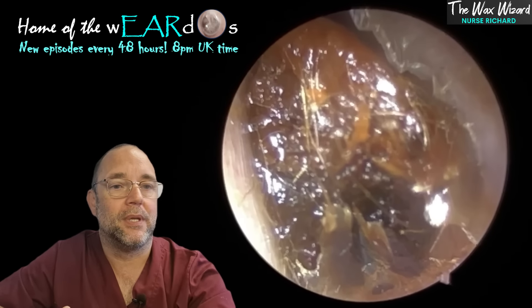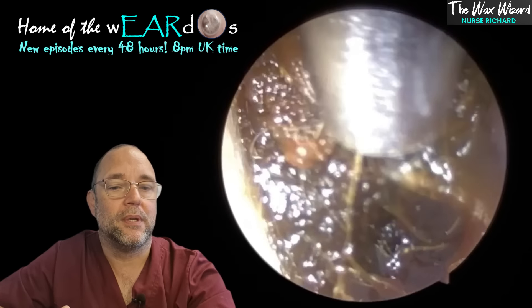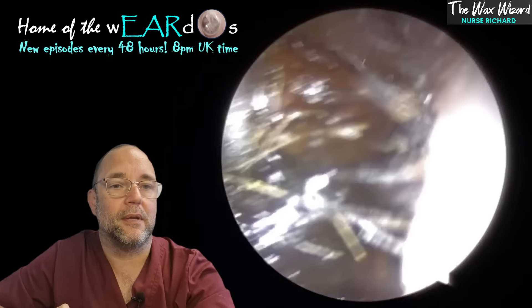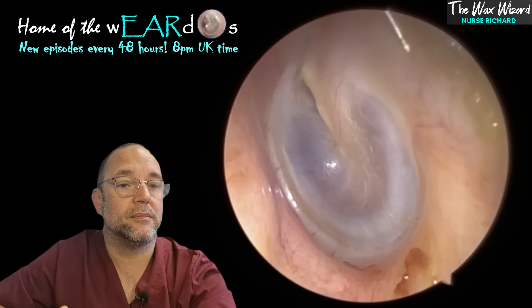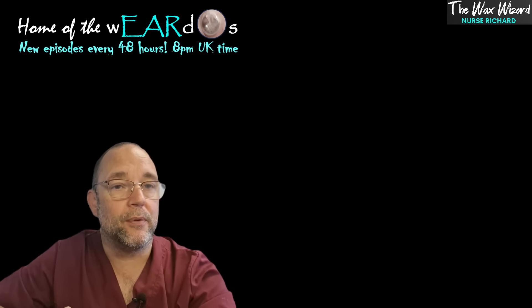It's also similar to when you drink a pint — you get the rings all the way down lower and lower. As you can see, there's a layer of skin enveloping that one, which can tend to squeak sometimes. I'm going to avoid that bit and get it from the top — and it came out pretty quickly. It softened up well, giving instant relief for the chap. A very happy camper indeed. Good-looking eardrum there, and a lovely clear ear canal.